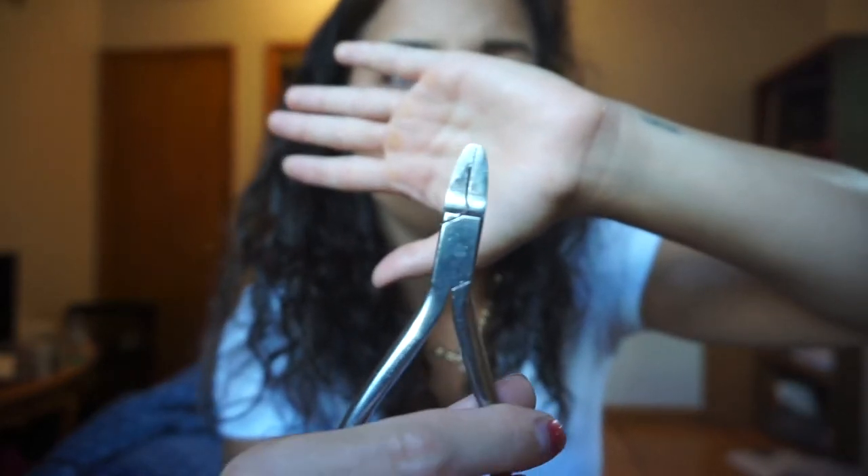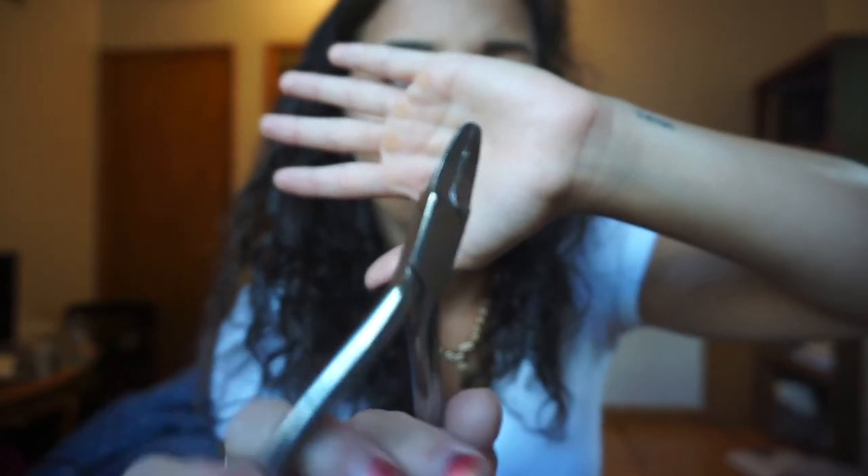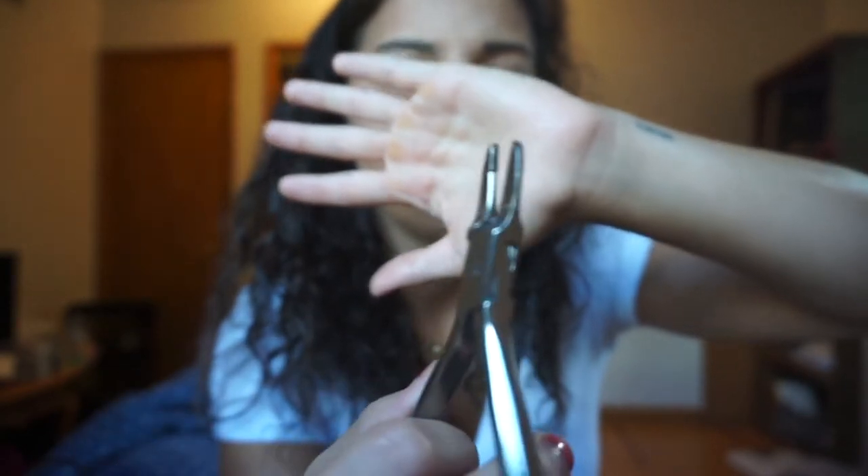Next is ribbon pliers. This is what orthodontists use to bend wires. Sometimes they need to make bends in the wires — like if there's a bracket off — they'll take a white pencil and mark where they need to bend it, then take the ribbon pliers and bend it how they need.